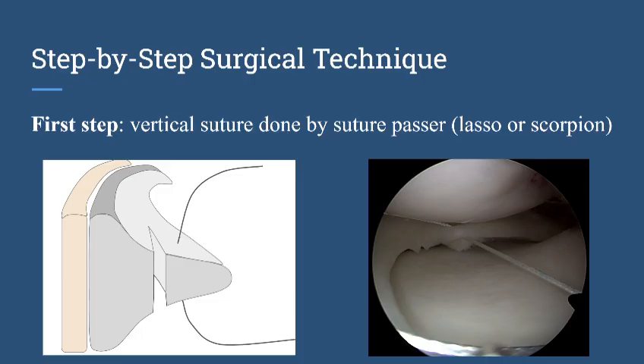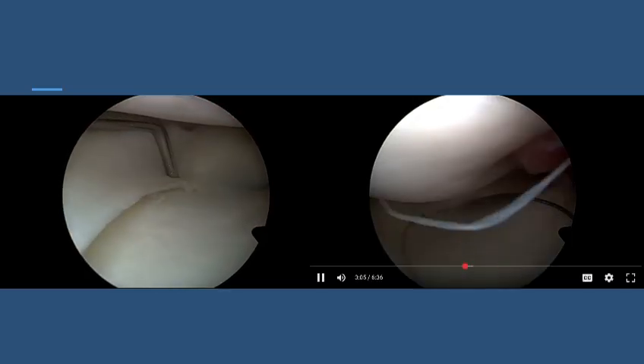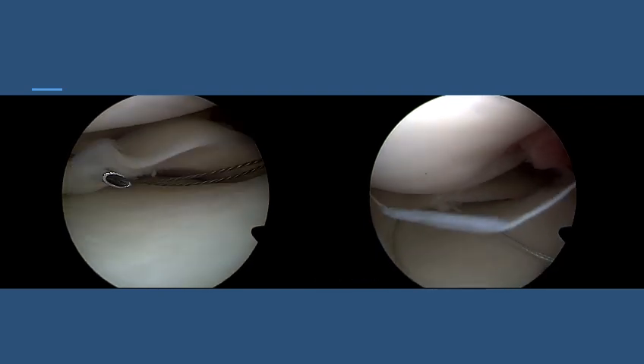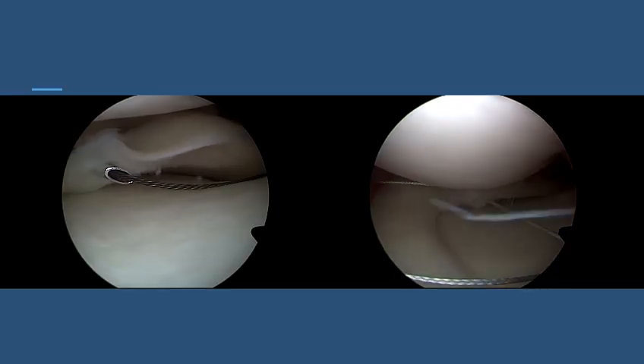The first step in this technique is to pass the vertical suture through the torn part of the meniscus. This is done after refreshment of the meniscus tear, and we use the meniscus lasso or micro lasso. You can see here in this video how we pass the nitinol wire, and after that we pass the vertical suture — the vertical suture is now in place.